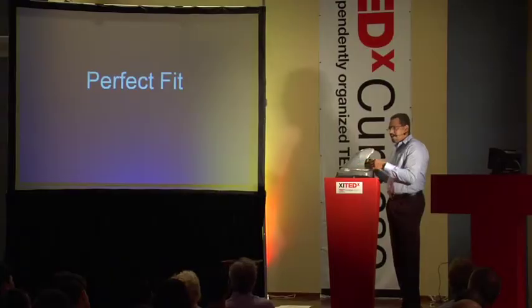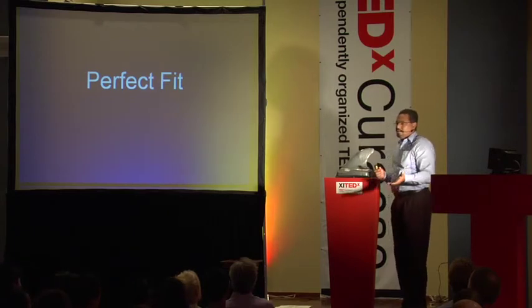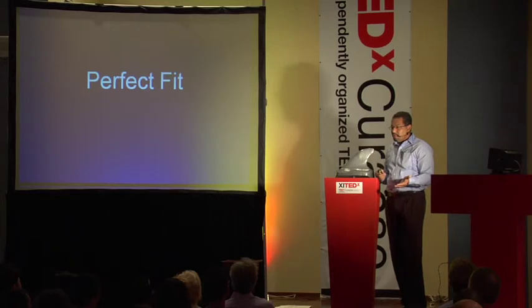And of course, if you have a device fitted around it, you have to realize that you have to have a very perfect fit, because any abrasion or movement of the device would just make a new wound and you're back in trouble.